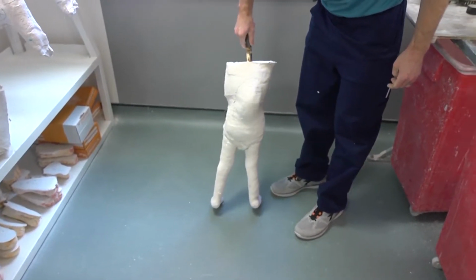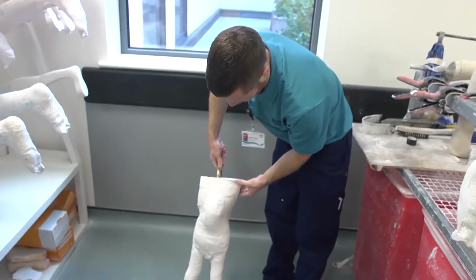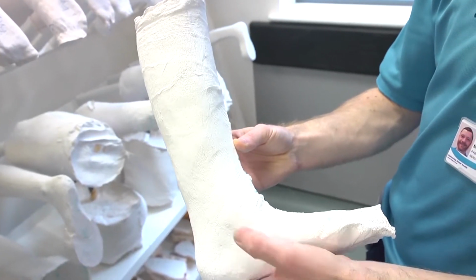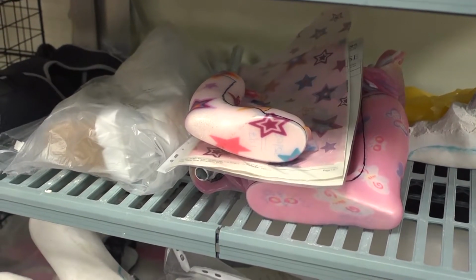One of the reasons it's so important that a child wears the orthosis that's prescribed to them is to prevent that deformity as much as possible. That orthosis will slow down that rate of change. It might prevent any further deformity or change for the worse, or it might just hold off when surgery can be performed. Some come for the first splint, they can be various different ages, but generally they're coming at quite a young age, maybe 2, 3, 4. So they don't always have the understanding at that time, but that's actually a good thing, because they see the benefit without any of society's impressions put upon it. They put it on and they walk with it.